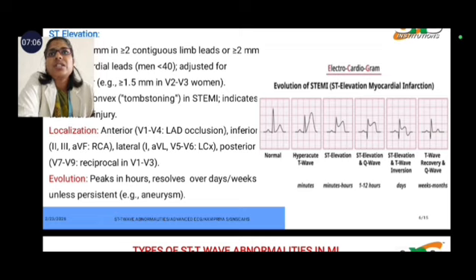So here once again the CBC, a laboratory test, is also done. CBC hemoglobin is about 12.8, and the patient's TSH level is also normal, 0.324. Here the ECG report is about ST segment elevation, that is ST elevated MI.